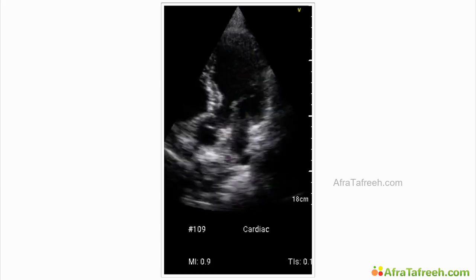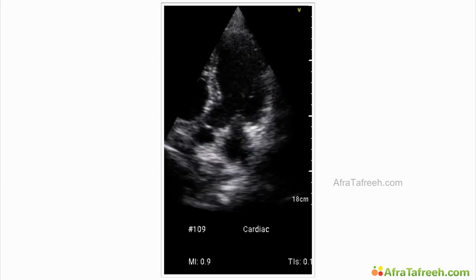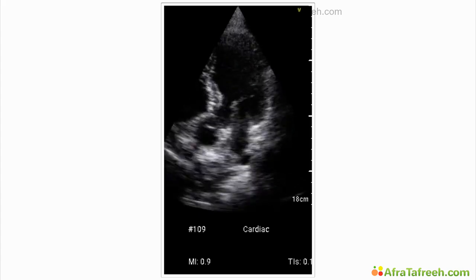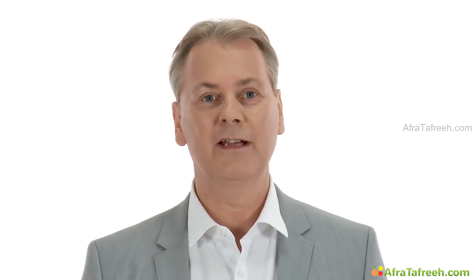Now, of course, it does not explain the systolic murmur by itself, but this is an example of a patient who needs further attention. She could have some form of regurgitation. We cannot tell simply by the 2D image. So be aware that there will be some ambiguous situations, but at least you will find those patients who need further attention, where you then could perform a more thorough exam or refer the patient to a specialized center.